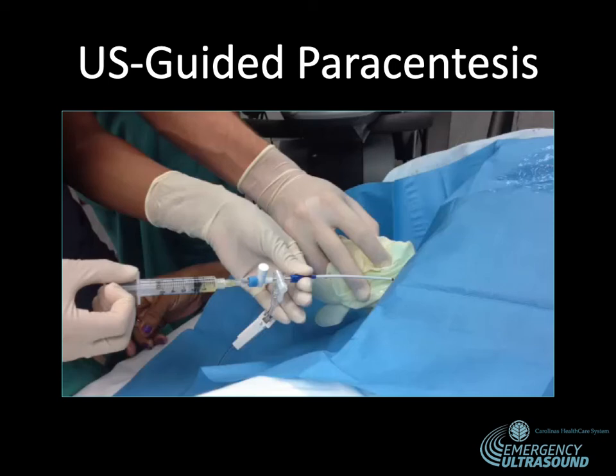So once we go in with the angiocath thoracentesis needle, if you want to do a large volume paracentesis, we can leave the catheter in the peritoneal cavity and hook tubing up to vacutainers, and then allow the fluid to drain. If I'm doing a diagnostic, I might just remove 60 to 120 cc's in order to send to the lab.